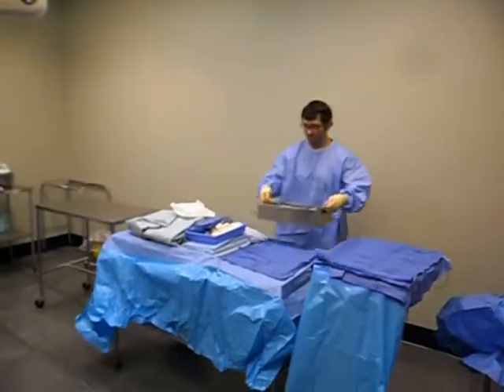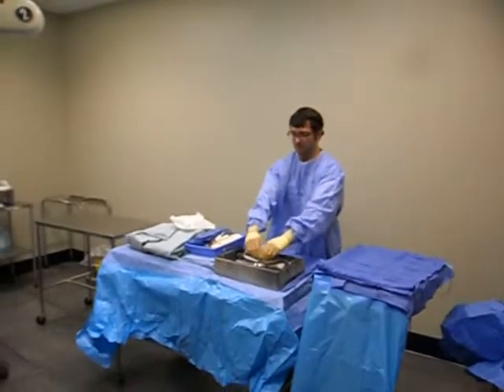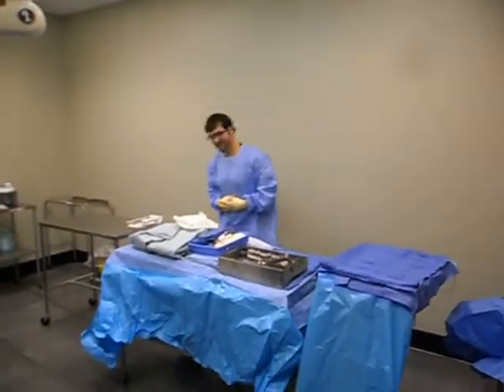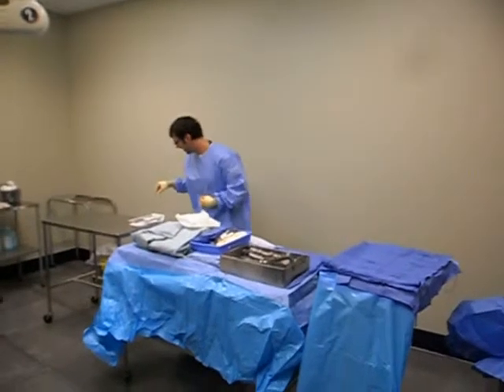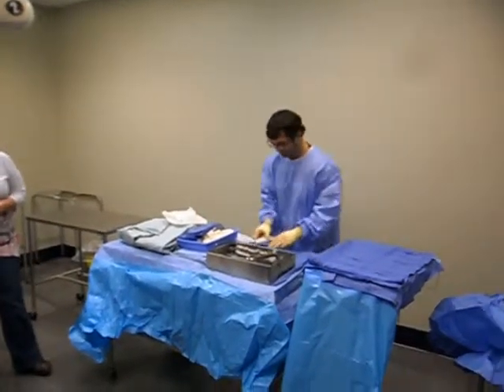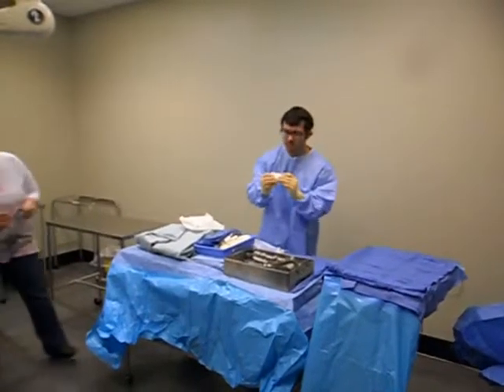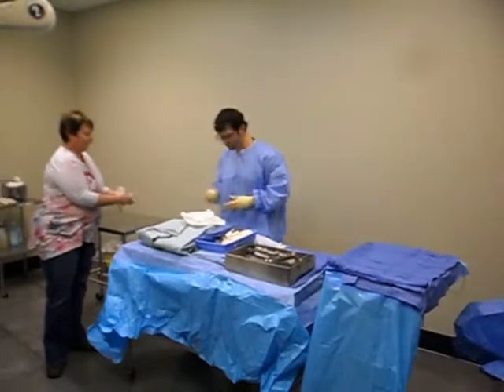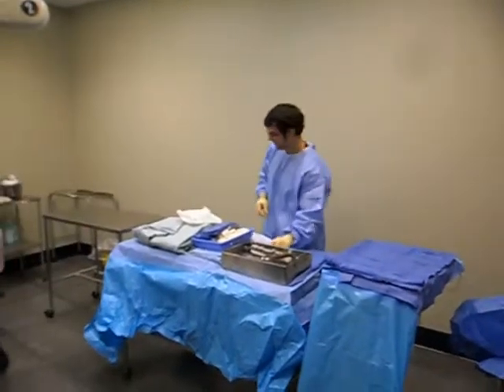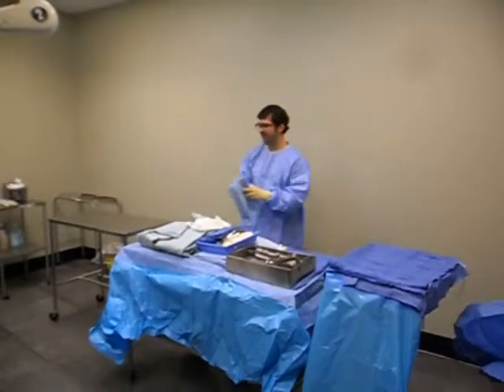Okay. Way over. I'll lift this up. Oh, they're all disconnected. That's good, I was hoping for that. Better get my stapler that I need. Very carefully. Thank you. Put this right here. Thank you. Suture, you're going to have tons of sutures, so it just keeps coming. Drape.